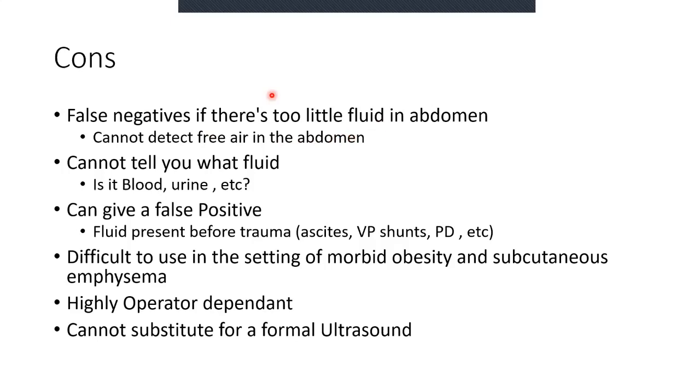In saying that, there's currently 2 studies going on that are trying to look at how the ultrasound can be used to see free air. If you look forward, in this case, to the pneumothorax lecture, it has to do with how air is dissipated along ultrasounds, and there's a study to look at artifacts around the liver that could point to free air. So maybe by the time you guys are a bit more advanced, I'll be listening to a lecture by one of you describing how free air is seen under the diaphragm in the ultrasound, and I'm really looking forward to that day.